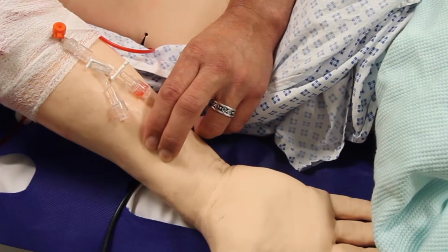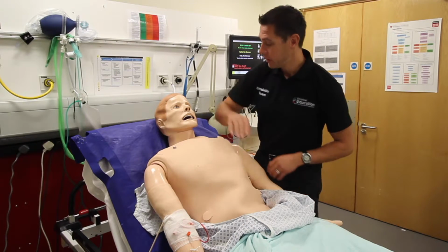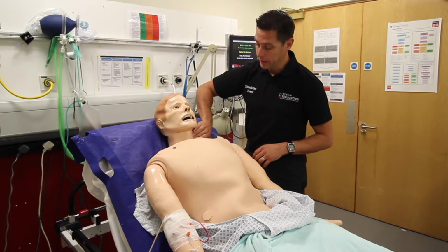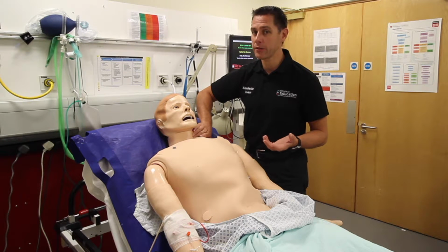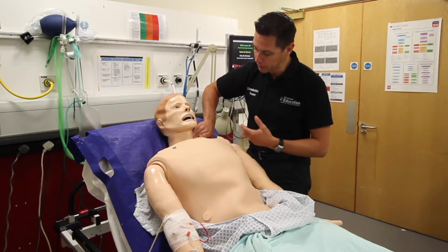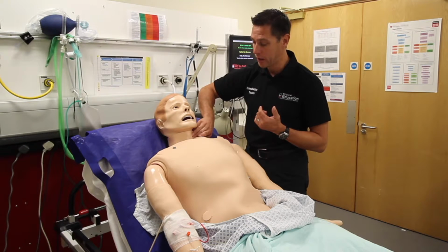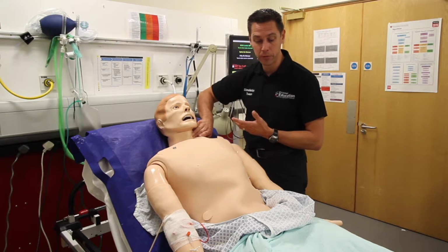So just a nice gentle pressure on there, and that should be fine. So that's his radial pulses. He's got carotid pulses both sides, and again, these can be quite tricky to find, but then in real people they can be tricky to find. So it's where you would normally expect to find it. So the same applies there. Press, keep a gentle pressure, and you should feel the pulse.